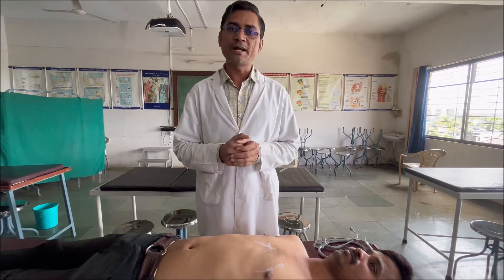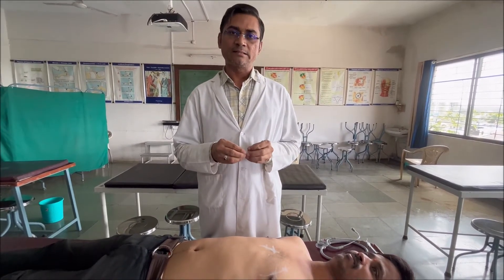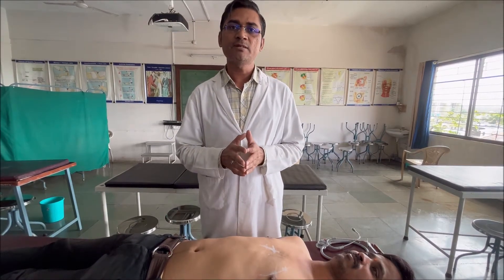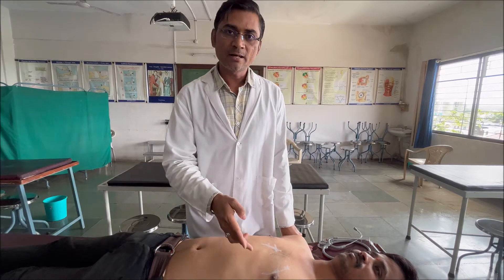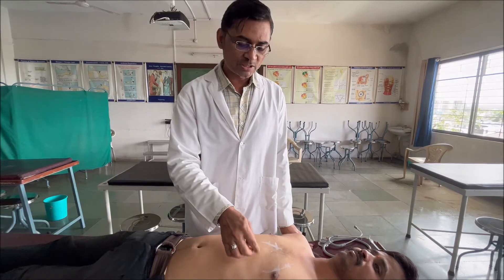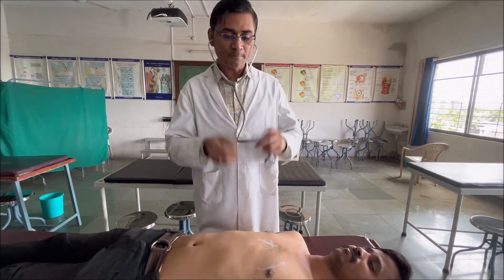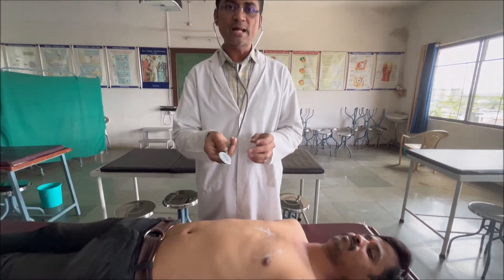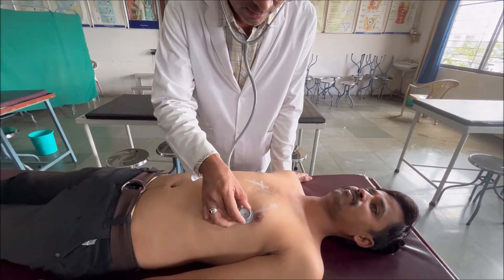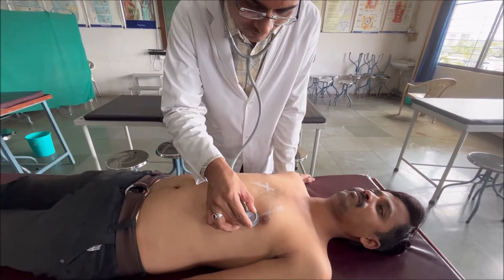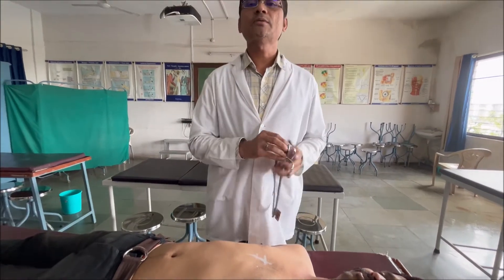As in a previous discussion, we have already found out the exact location of the apex beat. So you can place the stethoscope directly over that area for examination of the heart sound over the mitral area. In our case, we found the position of the apex beat in the left fifth intercostal space over the mid-clavicular line. Using the stethoscope, we place the diaphragm directly over the apex beat and listen to the sound. This is how the mitral area is auscultated.